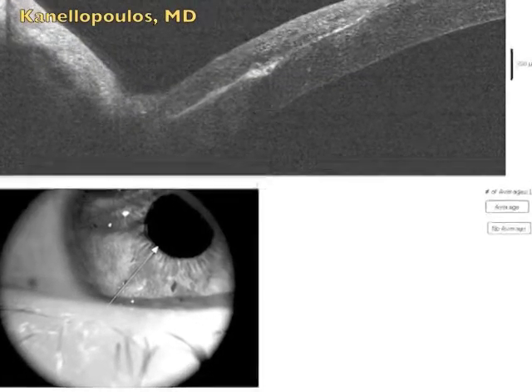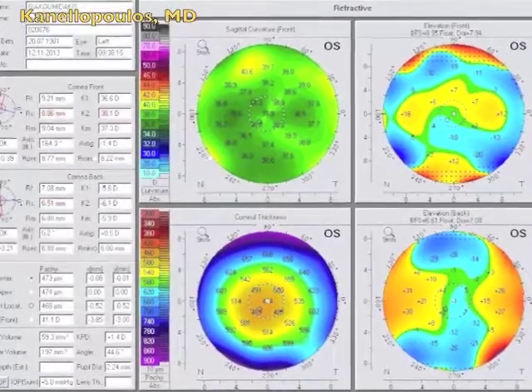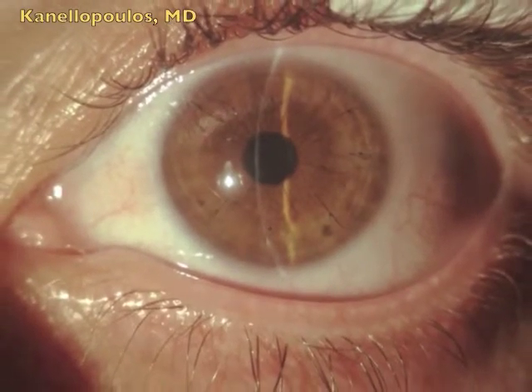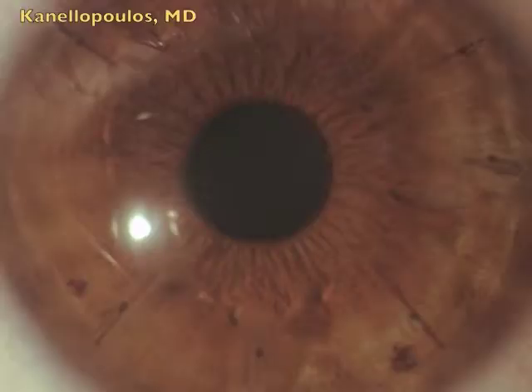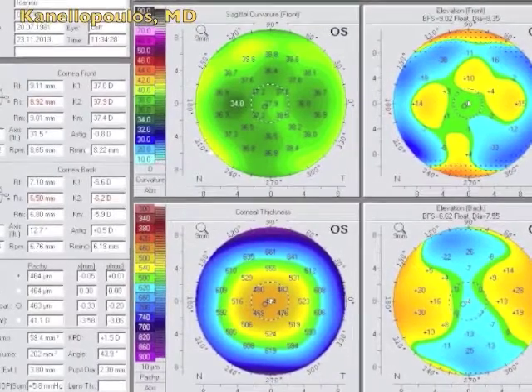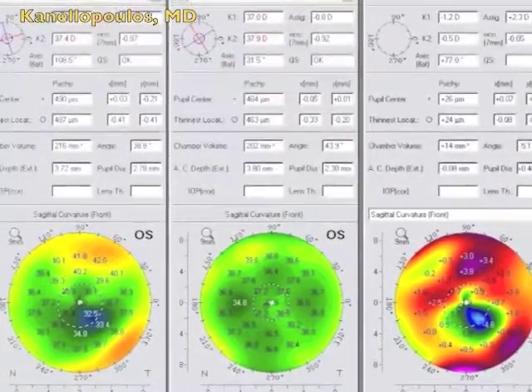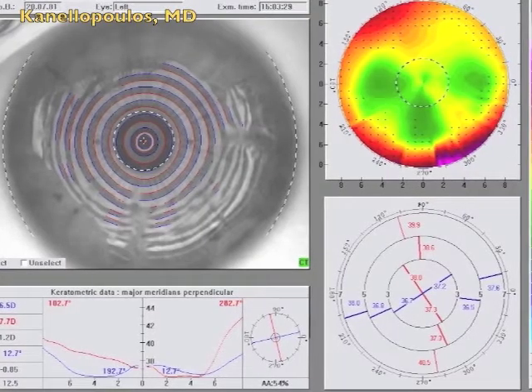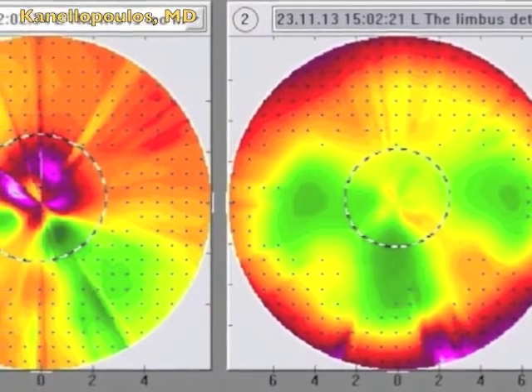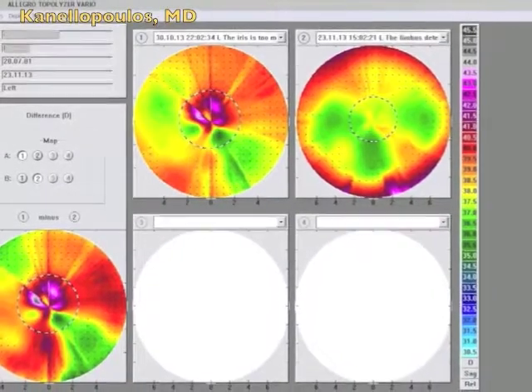On the Pentacam, you can see already normalization with very nice flattening of the central cornea. This is the next-day Pentacam. Now, going a month later — time to remove the sutures. You can see the flap is absolutely pristine; vision is 20/20 — no other treatment. The one-month Pentacam shows a nice flat central cornea, and the posterior corneal curvature has changed, which is testament to how superficial irregularity can throw off the Pentacam. The Placido disc images show perfect rings and a much more normal topography. This is a Placido comparison pre- and post-epithelial ingrowth removal and suturing — the difference map is extremely remarkable.